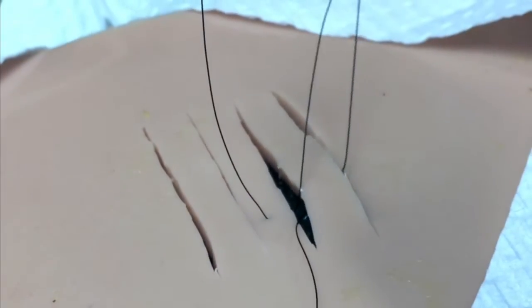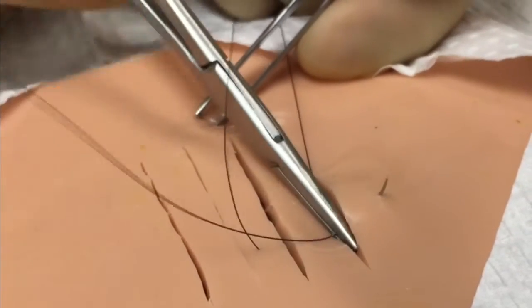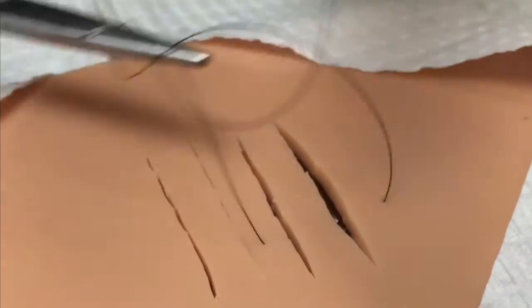Again, the tissue can be exited at the dermal layer and the needle driver can be used to enter the tissue in the far end of the wound. You would then exit through the epidermis and simply tie off the suture as you would with any simple interrupted suture.